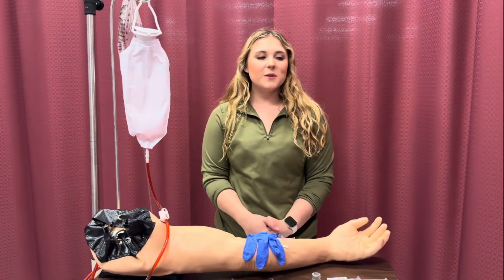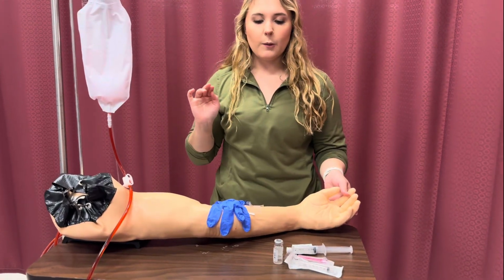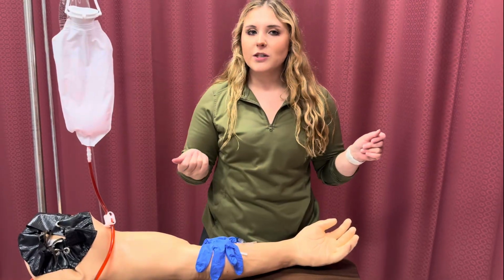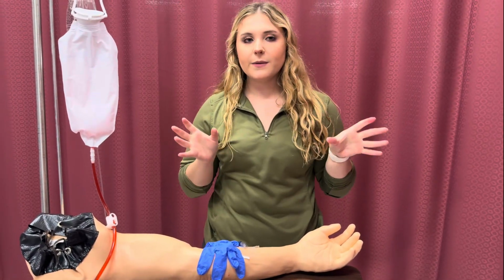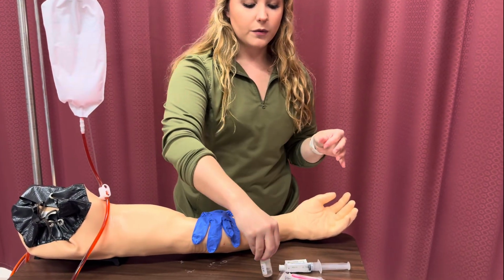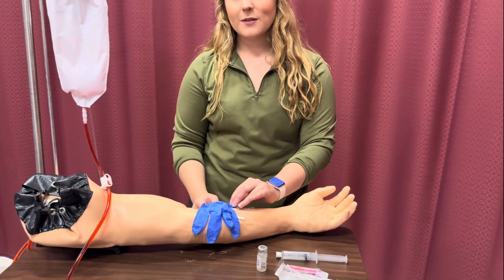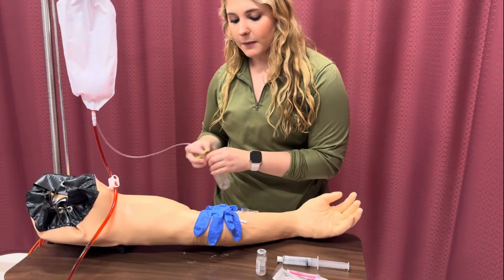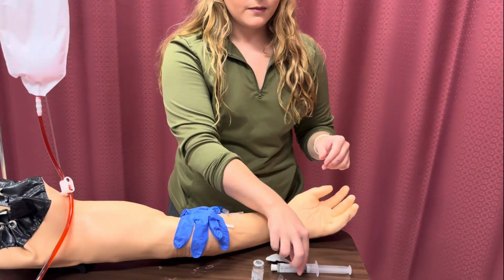Show you how to do an IV push and IV piggyback as well. So first of all, I would confirm with my doctor that we've ordered an antibiotic. I would go into the patient's room, confirm my 9 rights, and also name and date of birth. I would explain what I was going to do, so I'm going to go ahead and give him an antibiotic. So what I'll do first is clean off my, well, I would stop this if he is receiving meds. So I would stop, clamp it off. I would clean off my J-loop.